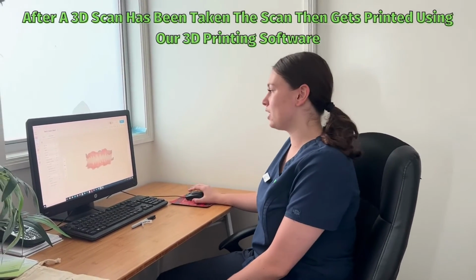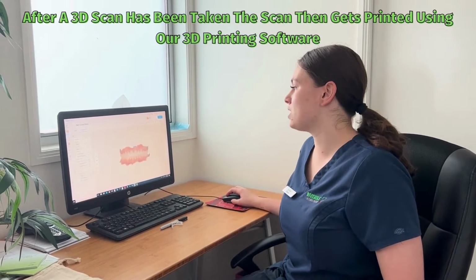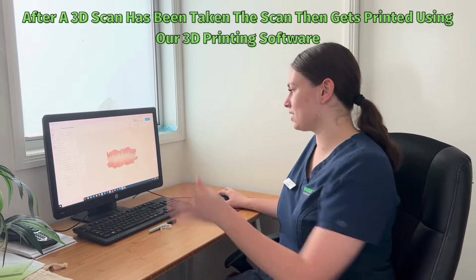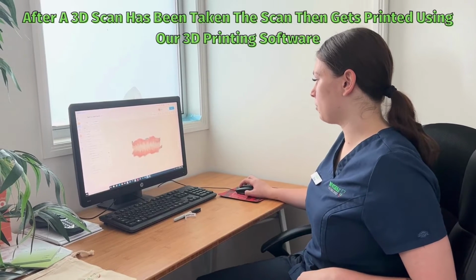So what happens when you are finished having your scan for your retainer is we come up here and make the 3D molds for your teeth so we can make your retainers. So here's a bit of the process. We can see your scan on our software here. We can also edit them on the software.